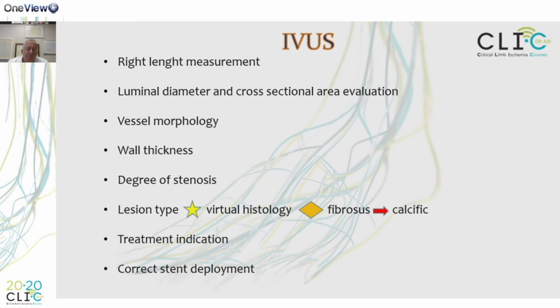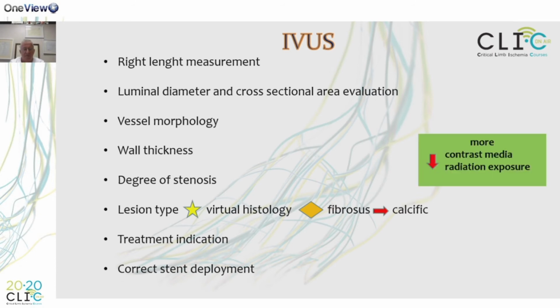Next. Intravascular ultrasound integrates angiography by yielding cross-sectional imaging with improved resolution. Typical measurements obtained with IVUS include luminal diameters, luminal cross-sectional area, vessel wall diameters, vessel wall area, plaque shape, plaque length, plaque volume, plaque composition, and overall plaque burden, which have all been evaluated with pathologic confirmation by many papers, especially from coronary.